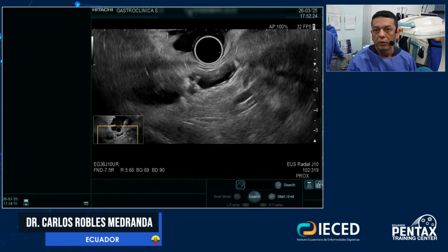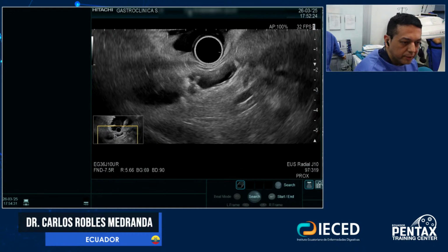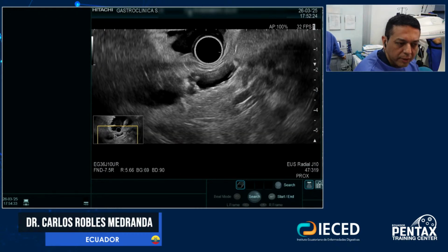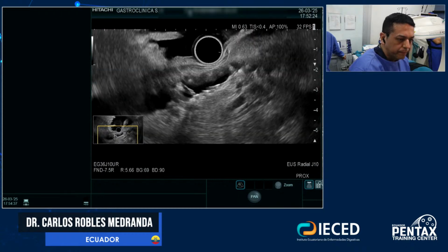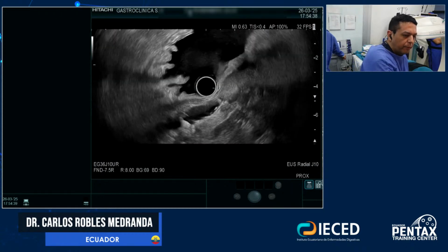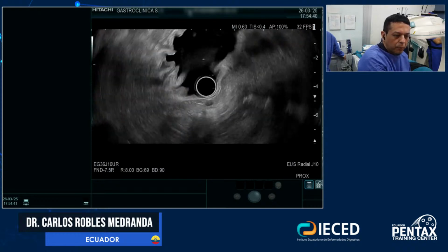US helped us a lot during a lot of years, but nowadays we have cholangioscopes and we can go inside, right? And we have different sizes also of cholangioscope, so we need to see what is going on there inside, because these are small, special things that we are not looking at normally in this kind of patients. Okay, so I will advance a little bit more.